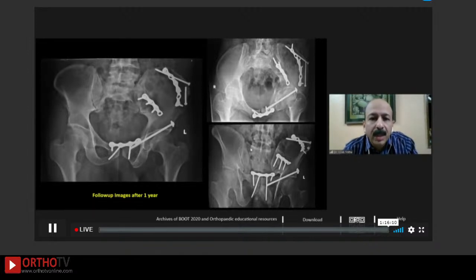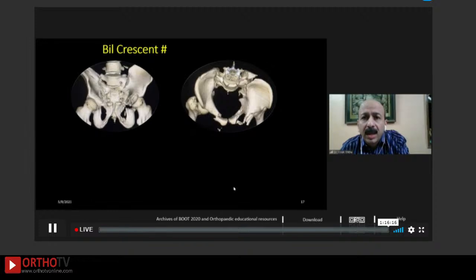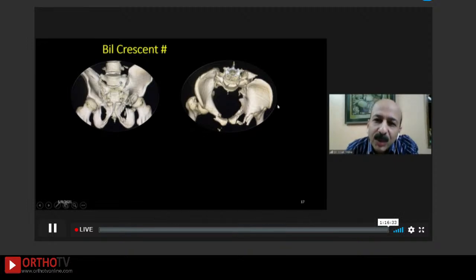This is his follow-up after 1 year where the things had united and he had good motions. This was not a young patient, and over the years, we have had the opportunity to treat around 9 to 10 cases now of such fracture. You can see here also, if you look at this inlet view, the entire sacroiliac joint has partially fractured and is dislocated anteriorly, lying in front of the ala.